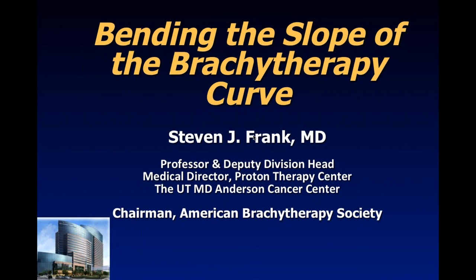And so the more that you can do outside the operating room, the better. I do think that everybody has access to an MRI today. I think MRIs are universally accessible. You just need to go and meet with your radiology colleagues. The diagnostic MR is standard of care. And then you can just add a 3D T2 sequence as an additional sequence. We've demonstrated and communicated that in the publications. And that would then be pulled into your treatment planning system as your simulation and planning MR.